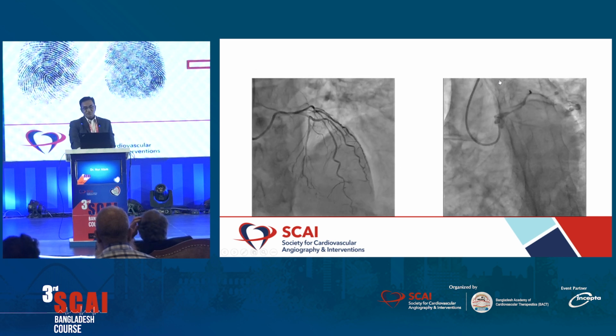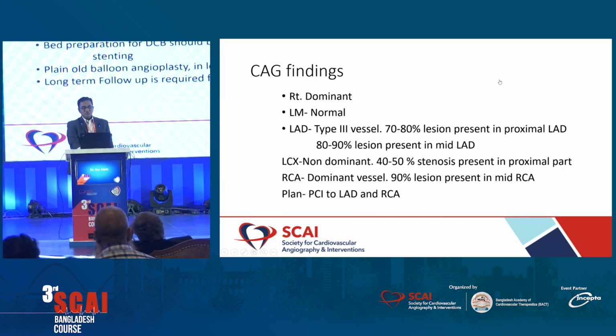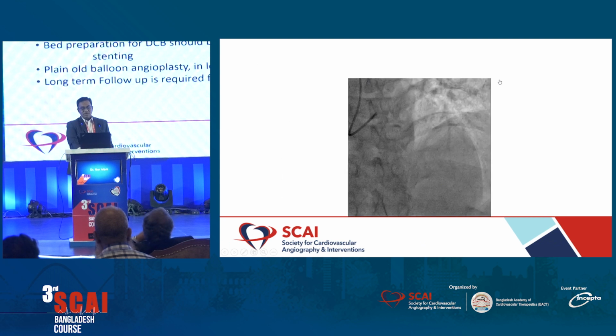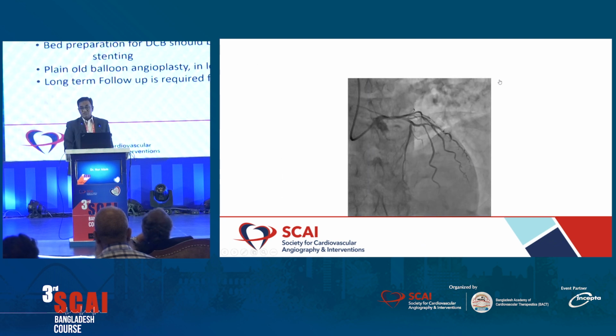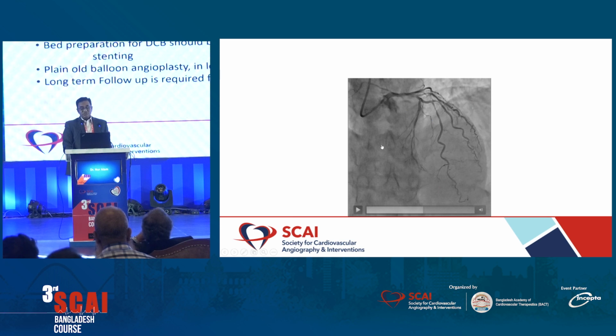So Mr. Chairperson, I will conclude here with a few take-home messages. Drug-coated balloon is showing promising results in PCI, especially in in-stent restenosis, small vessels, diffuse disease, distal vessels and side branch. Bed preparation for drug-coated balloon should be just like bed preparation for stenting.